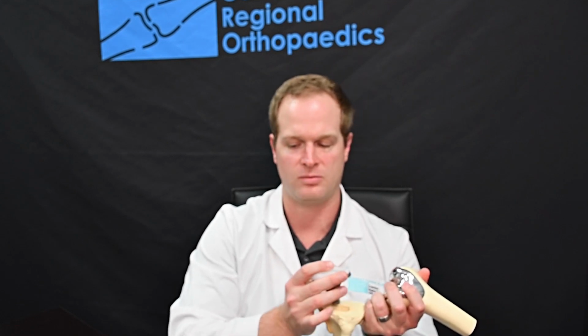A knee replacement is a type of orthopedic surgery for end-stage osteoarthritis or a couple other select versions of osteoarthritis to the knee joint. With a knee replacement, what we do is we make an incision on the front side over the kneecap, we move the kneecap aside, and we take a saw and we cut the arthritis off of the knee, like such.